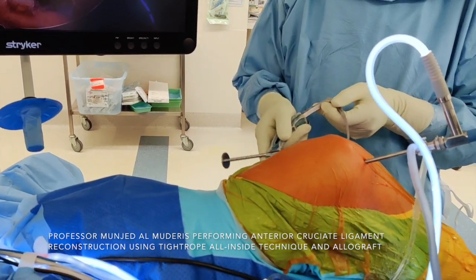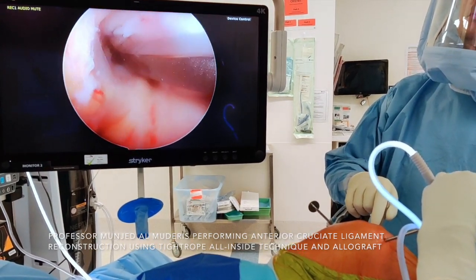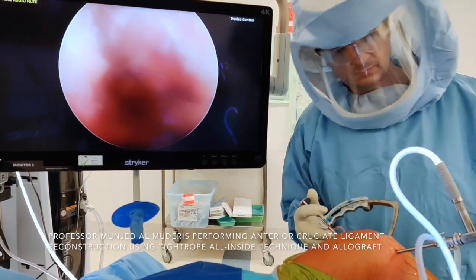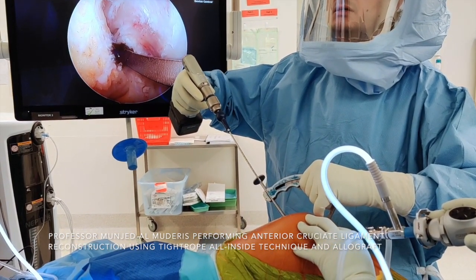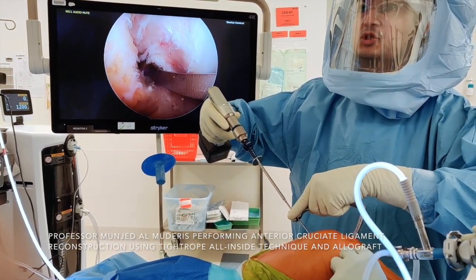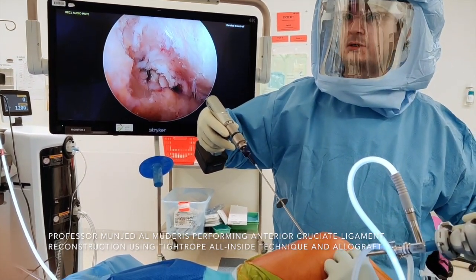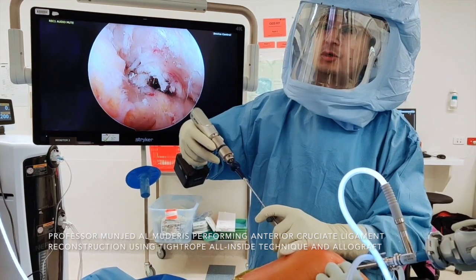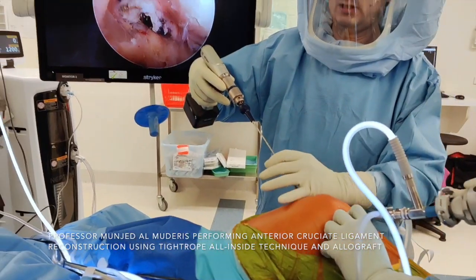I insert the femoral jig through the lateral portal, and it should sit exactly at the femoral stump of the ACL. I make a lateral incision at the femoral side. Using a flip cutter, from outside in, I exit the femur with the flip cutter. We remove the jig. I secure the trocar, then flip the drill part of the flip cutter. There is a black marker to identify the depth of my drilling.